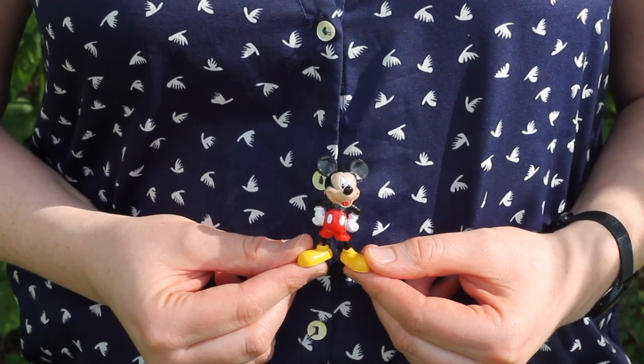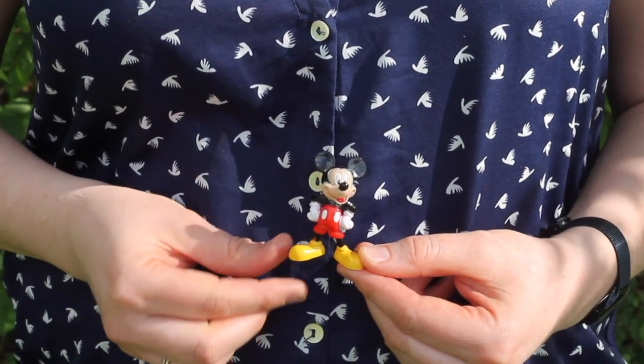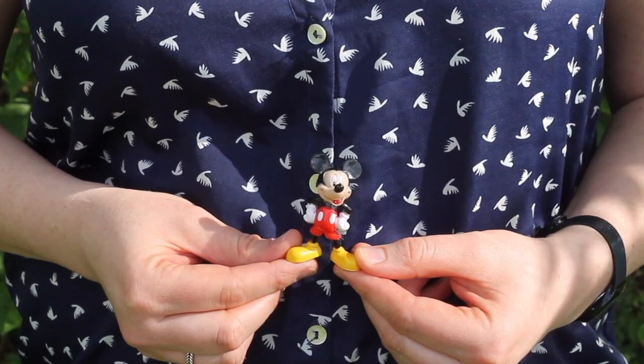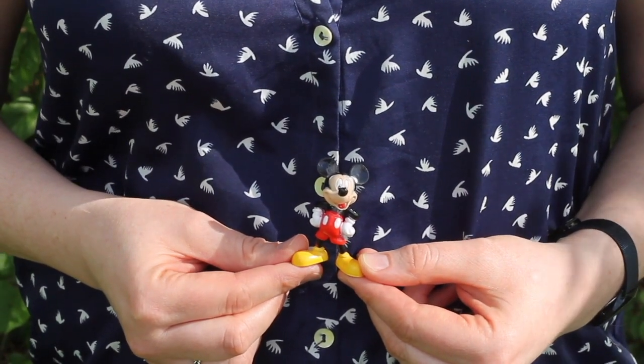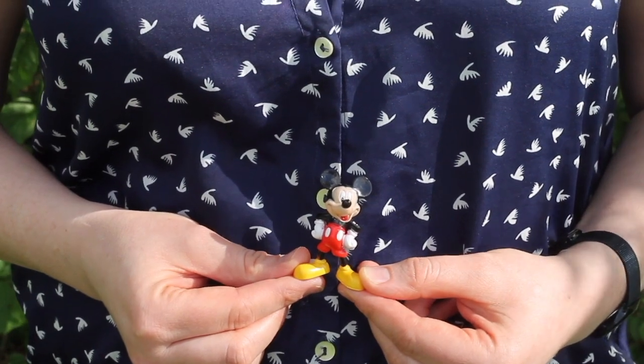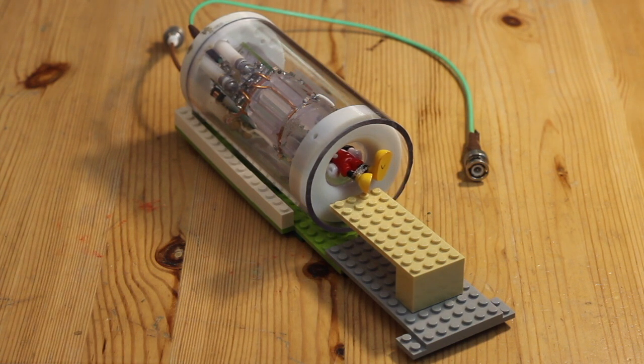For our experiment, we injected a small amount of human tumor cells into one leg of a mouse and left the other one as a control. We then gave the mouse deuterated water to drink for seven days. While the tumor was growing, it took up the deuterium. We put the mouse inside the MRI scanner, in a special coil or cradle that fits into the MRI machine.